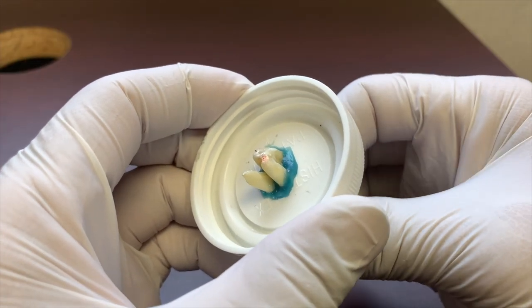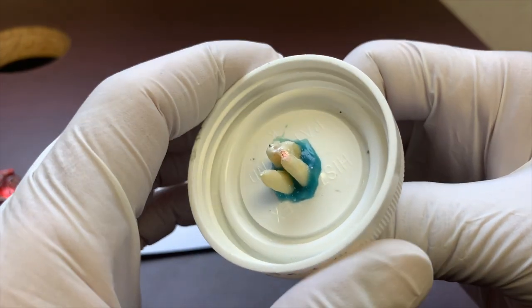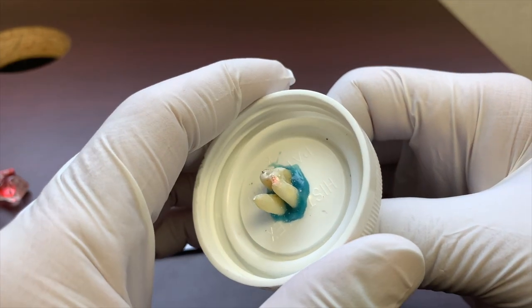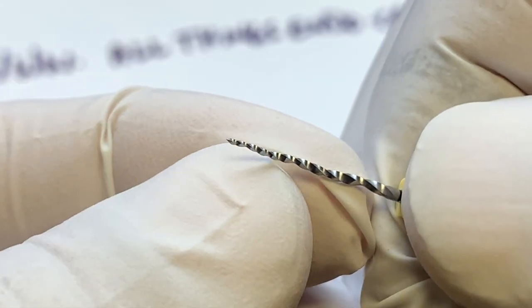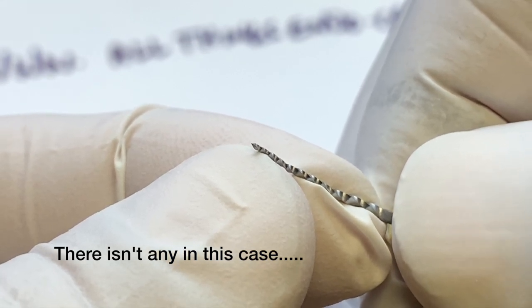What you do is run it a little bit, say a millimeter long. I'm not really an advocate of this, but I'm just giving you some tips on what some people do, and it may work for them. You can run the file long, and then as you pull it out, you can check to see where the debris is cutting. Then you would say, well, now I've machined the inside of my tooth.